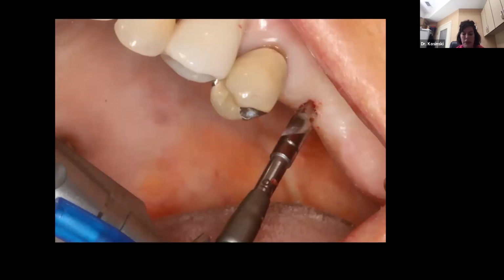Next in the Hahn system, I will use the pre-measured 3 millimeter osteotomy burr. Again, there is a clear delineated line on the burr, which helps me control position. This is an 8 mm long burr, so I am compensating for 2 mm of soft tissue.